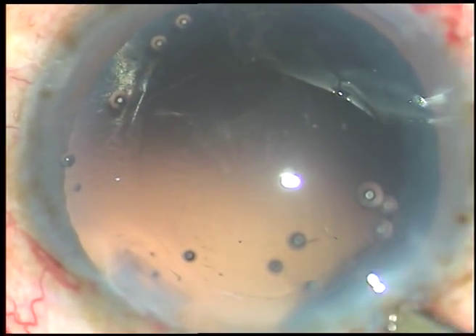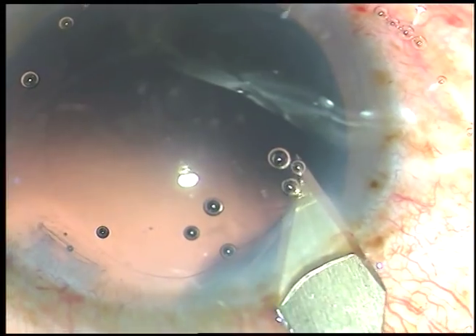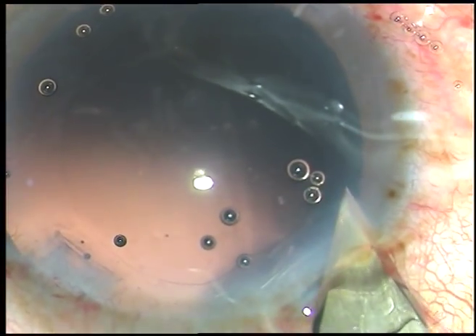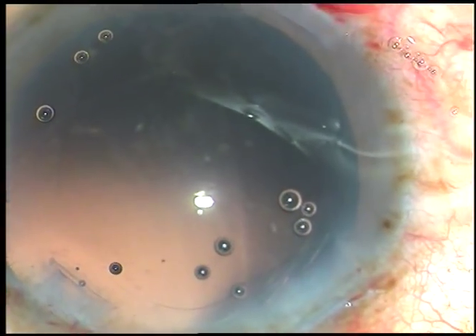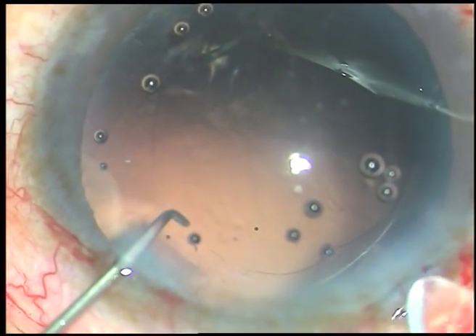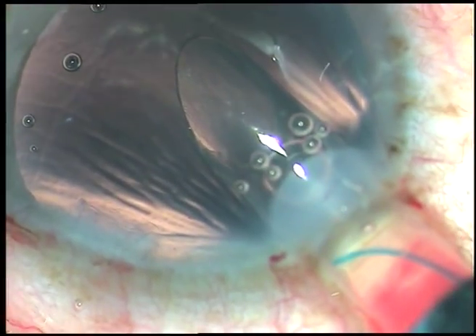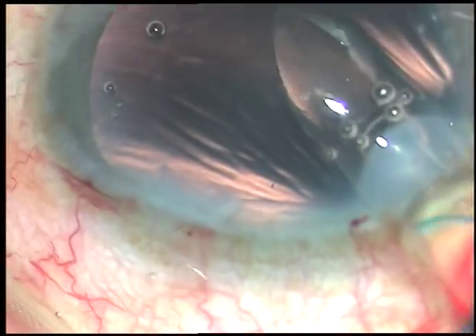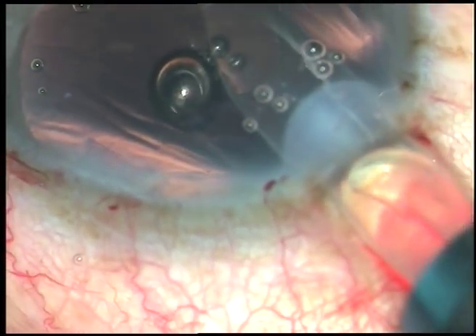In this case I have selected a multi-piece intraocular lens — a hydrophobic multi-piece IOL from AcrySof multi-piece. I increased the main incision to about 3 mm; the main incision was 2.8 mm and now it is about 3 mm. The advantage is that without stretching, the cartridge goes into the anterior chamber. And now I am screwing out the lens.